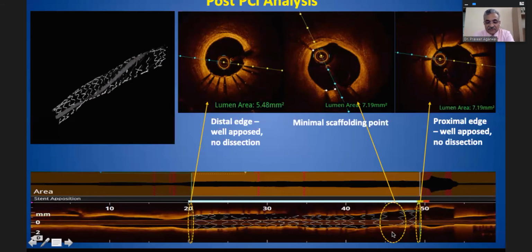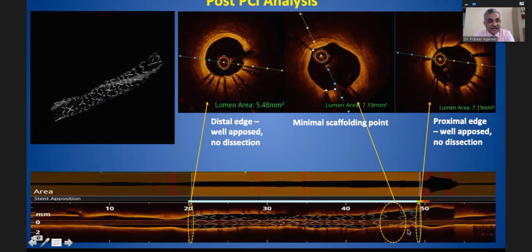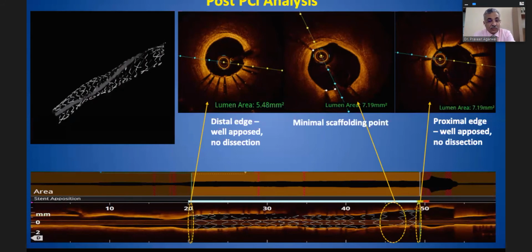When we measure it, the stent was placed as 2.75 by 26. Now this has become nearly 29.5, close to 30 millimeters. So the stent has got proximal stretching without any undue pressure on the stent, and this has happened. This is all a fibrotic lesion. And we see often, if you oversize the balloon, you can do that. But this is a nominal size balloon, 2.75 versus 2.75.